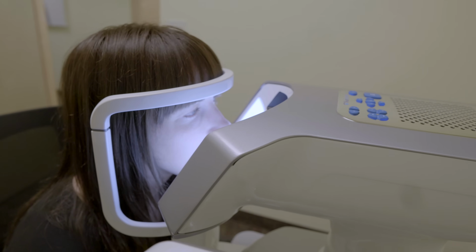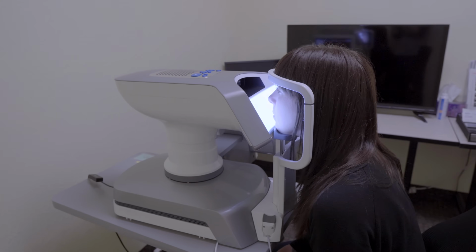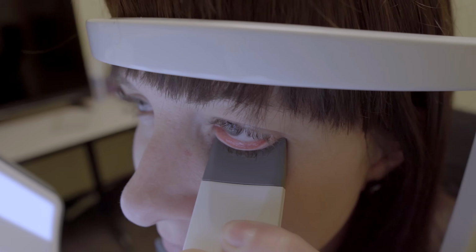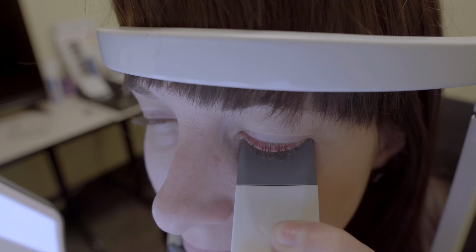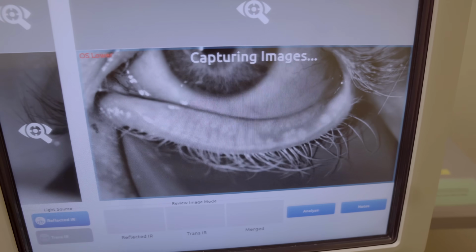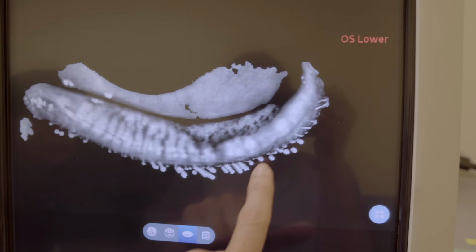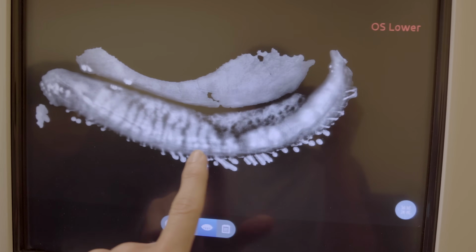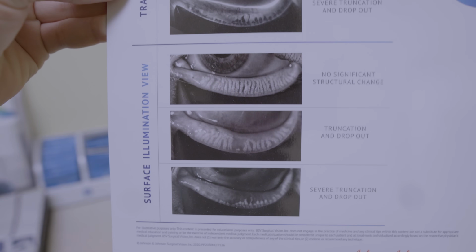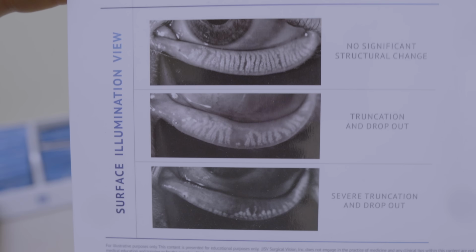Now, the next test that we do is something called Meibography. This is an imaging or scanning technology that will scan both your lower and hopefully your top eyelid. Sometimes the top eyelids are tough to image, but the lower ones are the most important anyway. But we scan your eyelid specifically to look for how many oil glands remain. For a lot of people, these oil glands in your eyelids, which we call the Meibomian glands, can eventually get inflamed and clogged up and potentially even atrophy or die off for some people.